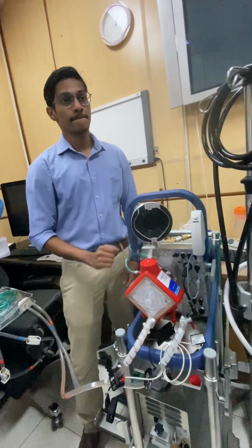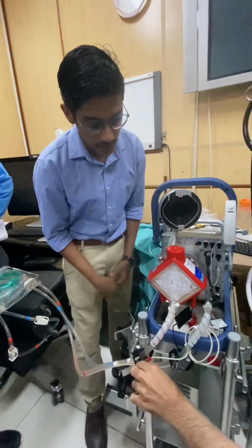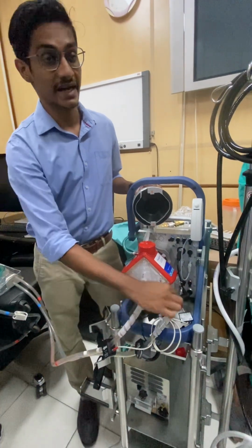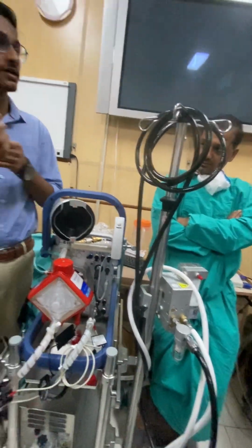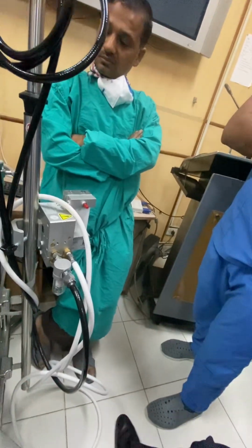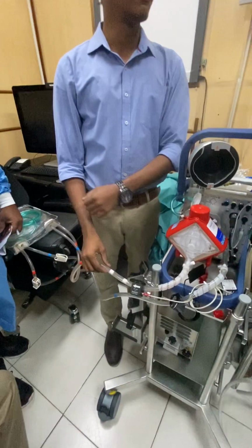So if air comes into the artery, in the blood, then what will you do? Sir, in the venous side, what happens is that it's a negative suction. So if there is any small opening of the cap or anything happens on the cannula side, air can come in due to the suction. But this is a positive side. Even if you cut it, blood will only come out. Even if you open something.